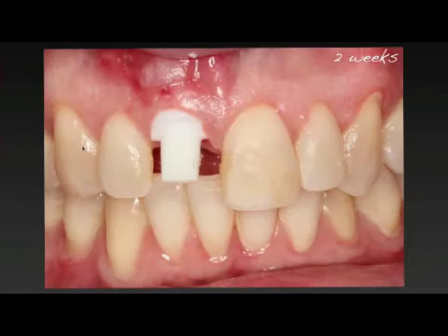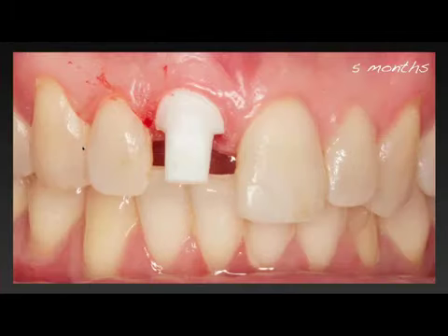And at 2 weeks of healing, we can see how the soft tissue has migrated up. And that was expected after what we saw, but we're going to allow this to heal a little bit more. And at 5 months, we have very nice soft tissue, with the margin of the implant being prepared in this case to try and bring it more apically for aesthetic reasons.